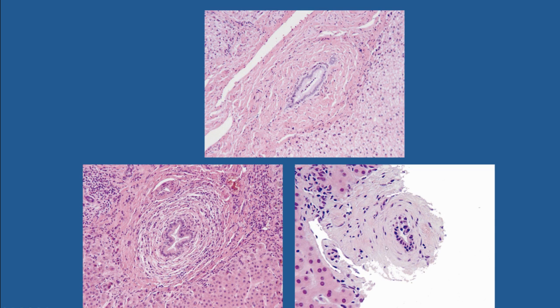bile duct. The other thing that I want to remind you is that if you look at these cholangiocytes, they look pretty damaged. Here is the normal bile duct that I showed you earlier. I talked about the rosary bead or the pearls on a string appearance. And you see how they're very uniform cholangiocytes. Here we have cholangiocytes that are irregular, that are hyperchromatic, and that are not respecting the space between each other. There is some overlapping of nuclei, for example.